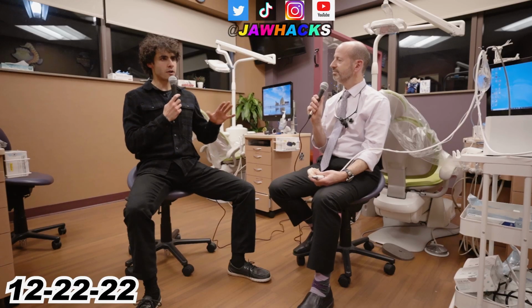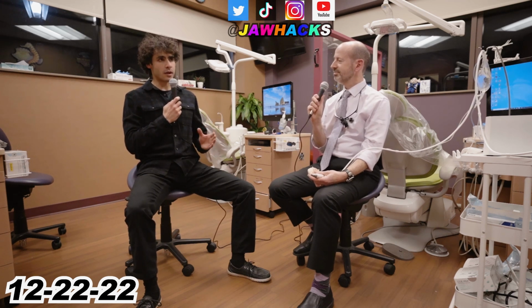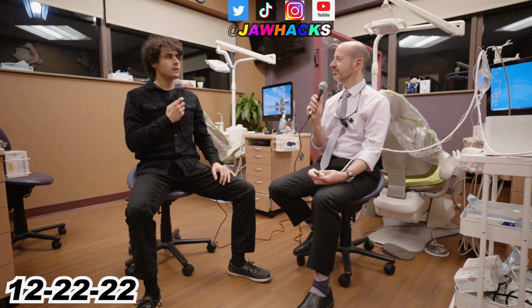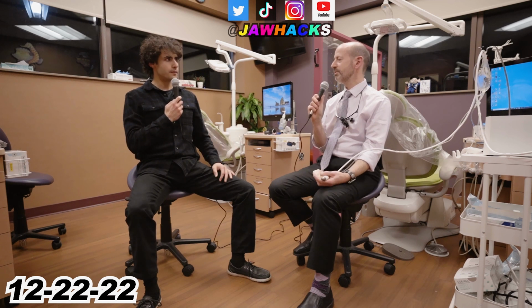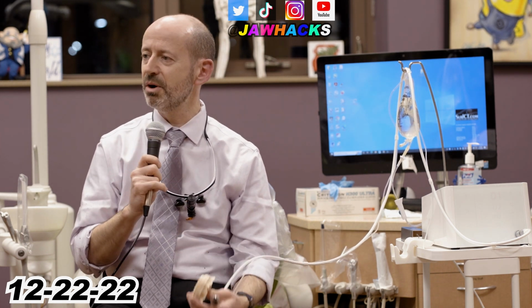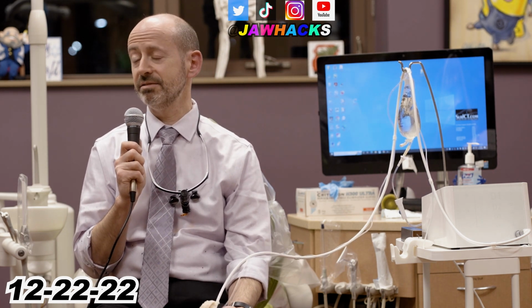PIEZO. And how do you determine that? From a cone beam. So every patient is different. Every single one. You can't generalize and say it's better to put it right in this spot between these two teeth, or further forward or further back. No, it's a crapshoot unless you're actually looking at the bone of the individual patient. That is correct. You need to look at it. Practitioners who don't use cone beam and just guess between premolars and molars in a certain area, it's a guess.